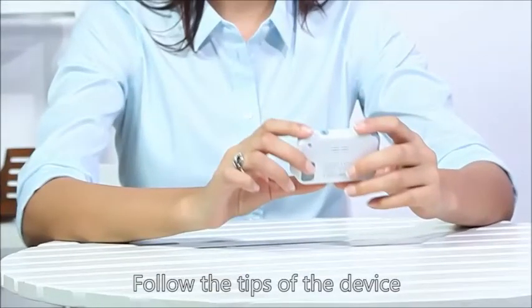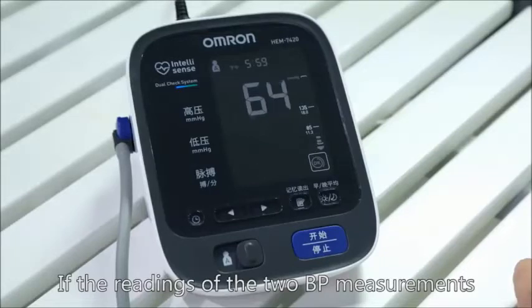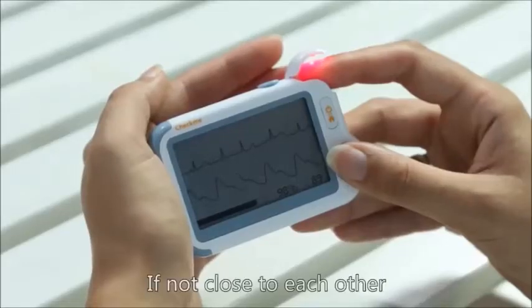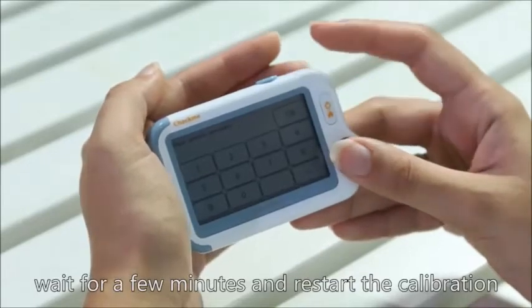Follow the tips of the device. The calibration will be done twice. If the readings of the two BP measurements are very close to each other, the calibration is valid and finished. If they are not close to each other, wait for a few minutes and restart the calibration.